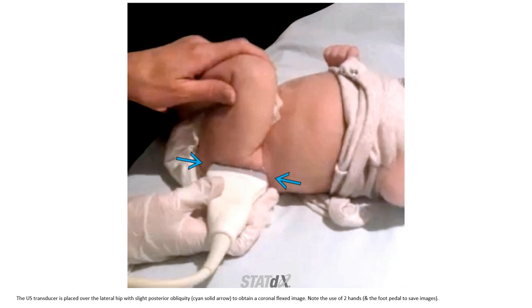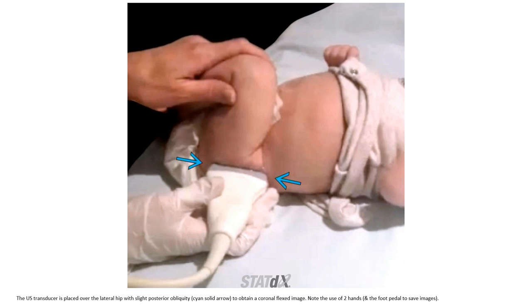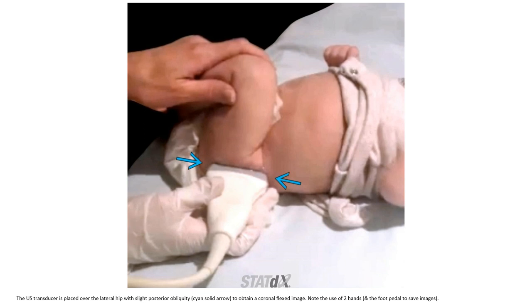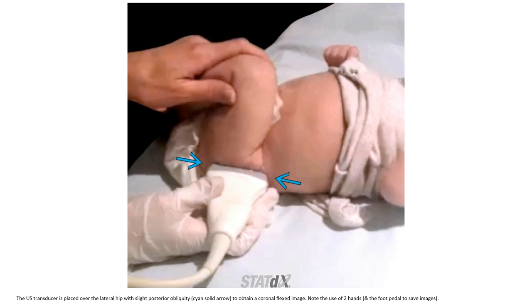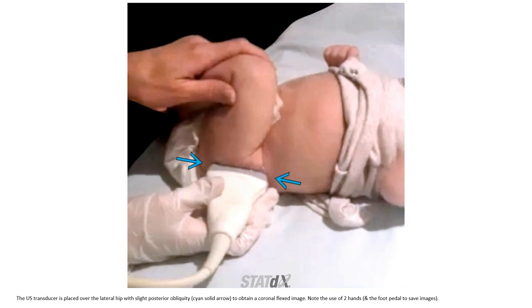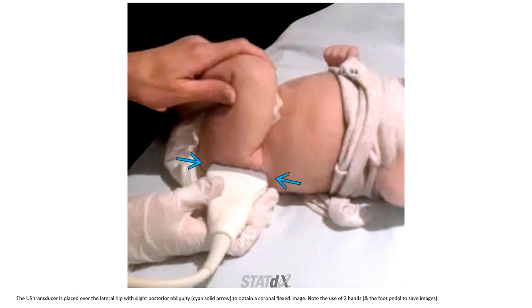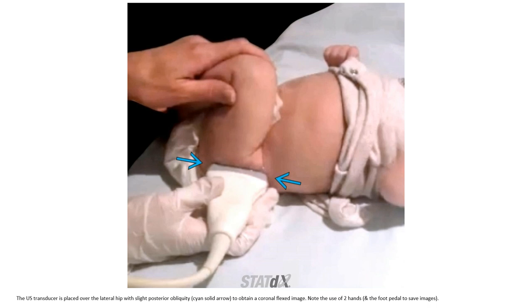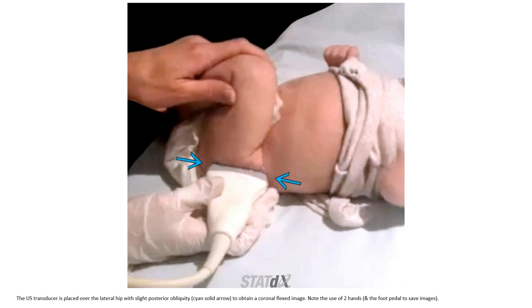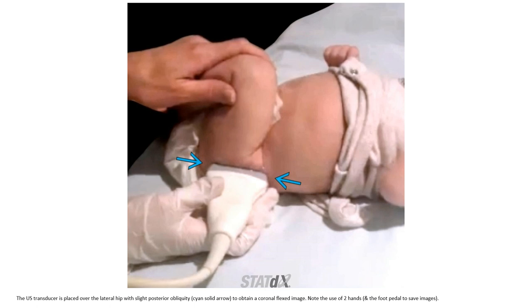This is how to place the ultrasound probe. We place the ultrasound probe on the lateral hip with slight posterior tilting. To obtain a coronal flexion image, note the use of two hands.